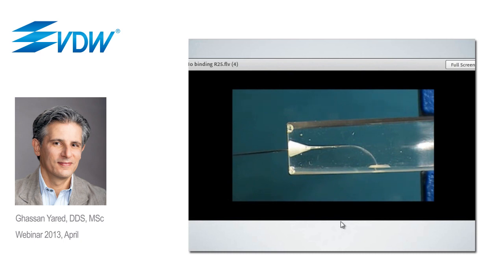And this is done with a reciproc instrument. So the irrigant is placed in the canal, and now you will see the reciproc instrument being used in one shot from the coronal orifice to the apex, without removing the instrument from the canal, without cleaning the instrument, without checking the patency. You know that you cannot do this with any other instrument.